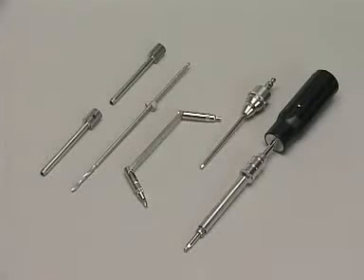The insertion of locking head screws requires these instruments: two threaded LCP drill guides, the 4.3 mm drill bit with length markings, the 4.5/5.0 LCP universal drill sleeve, the screwdriver shaft with the quick coupling, the torque-limiting screwdriver, and screw-holding sleeve.